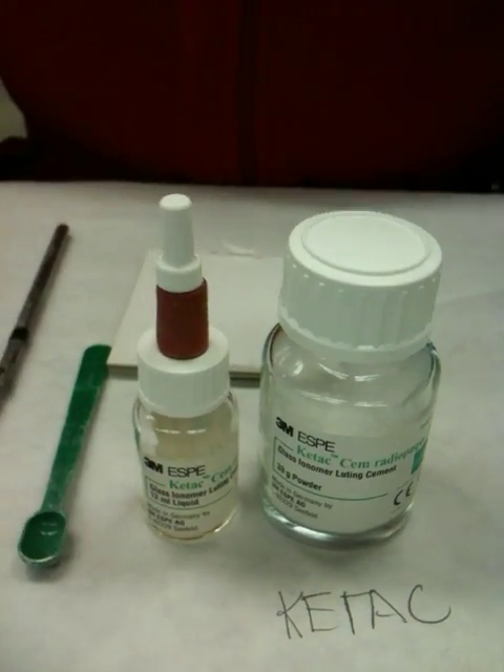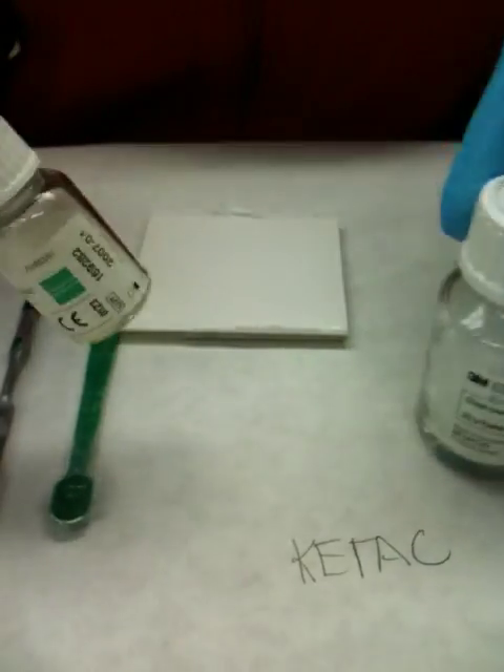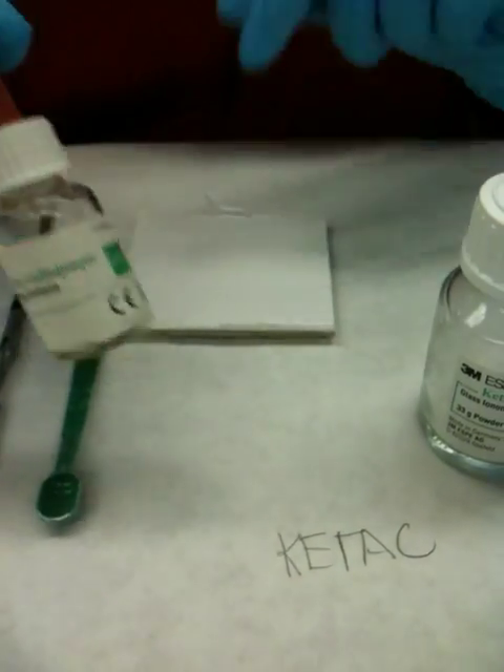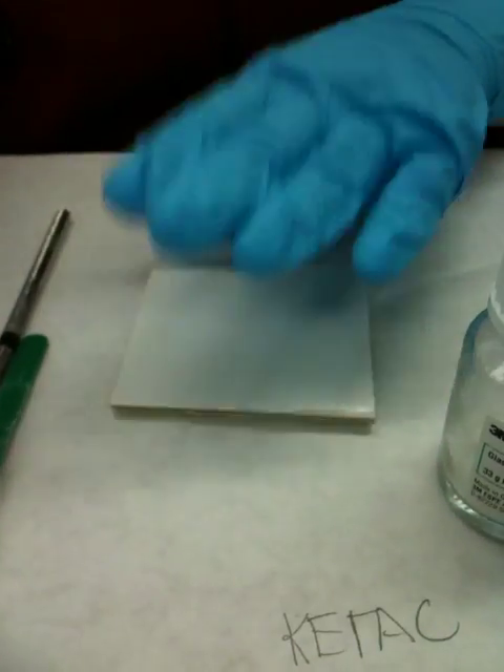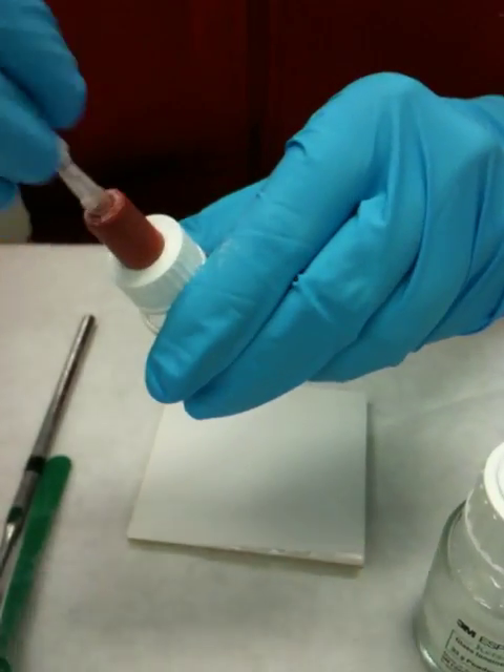I'm mixing glass ionomer to become a permanent cement, and the brand we are using right now is Ketac, it's also known as that. Here's my paper pad that I'll be mixing on, and I'm unscrewing it.